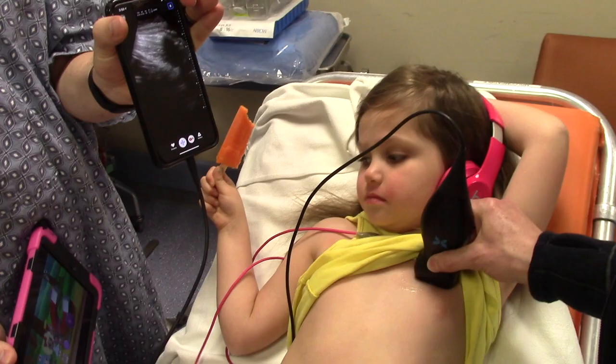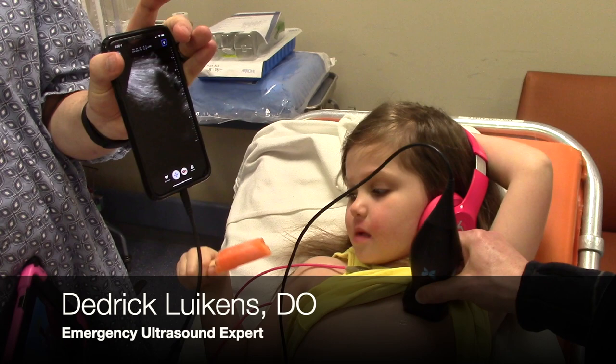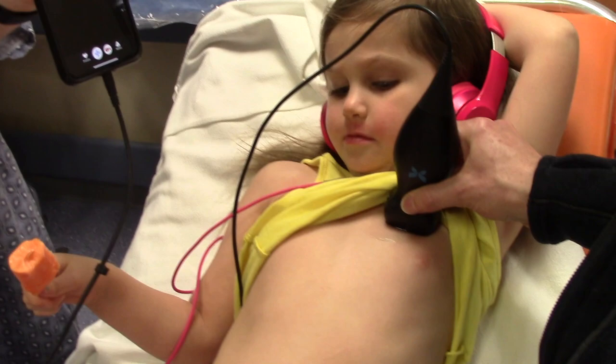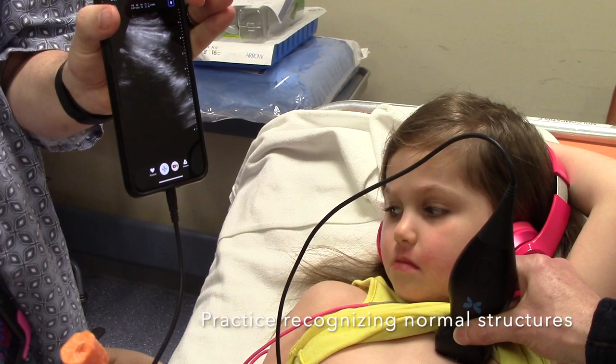Here's Eleanor's chest and you can see we're just above the wonderful normal cardiac activity. I'm just sliding up a little further north. Ellie, take big breaths for me — big breaths. And even with normal breathing, you can see this line right across the top here, which is beautiful, perfect lung sliding. And that looks really great.